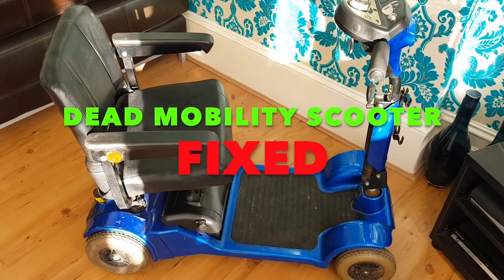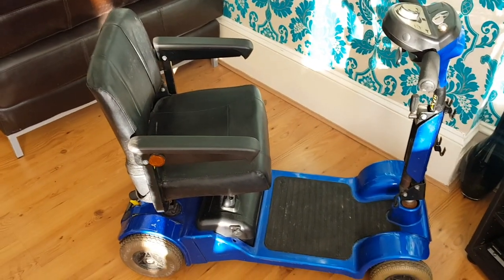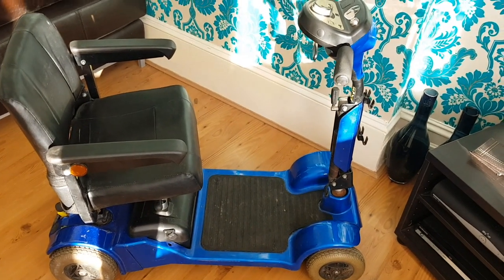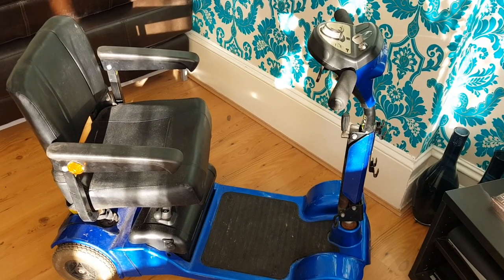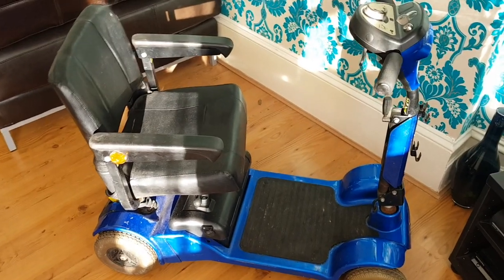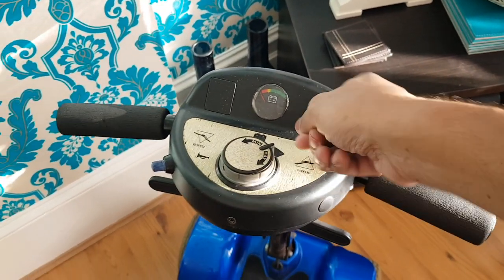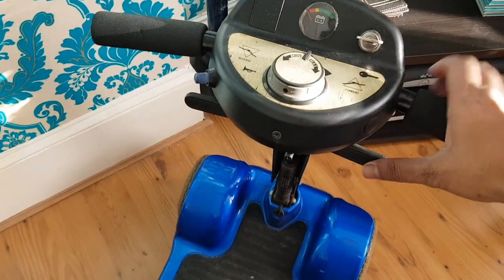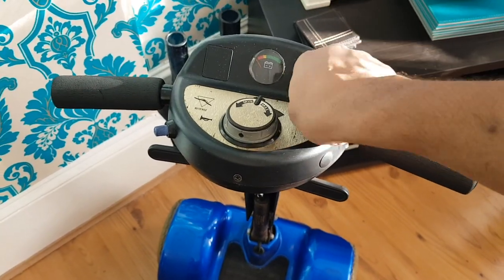Hey guys, this is Doug Will Fix It, and we have a mobility scooter in the house. My dad picked this up from a charity shop for free basically because it doesn't work. He wanted it for my uncle to use abroad, so he said to me, can you have a look at it and see if you can get it running? He told me the battery's been changed. There's no power at all — it's dead. You can see the battery indicator, it's got a little horn, it goes forwards, goes backwards, but it's completely dead.